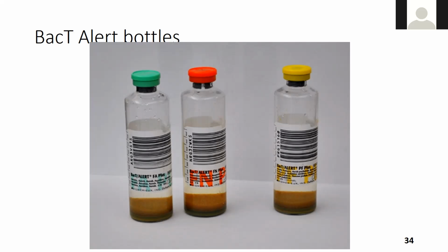But if you missed it, like, hey, patient's already had a dose of antibiotic and now we want blood cultures, probably not ever going to grow anything out of that bottle, because you're about to put blood in the bottle that has antibiotics loaded and it just won't allow the organism to grow if it was there. So a lot of times, like I said, you may have an option of a charcoal loaded bottle to absorb antibiotic to help you recover the organism if it's still growing against that antibiotic.